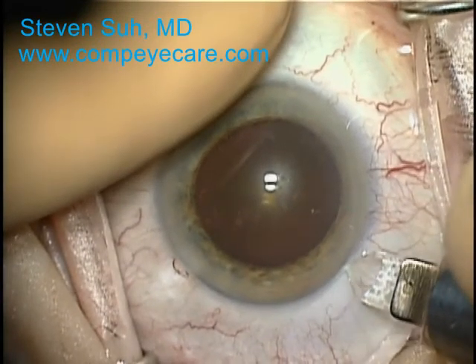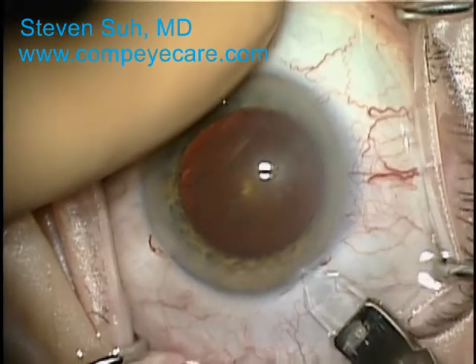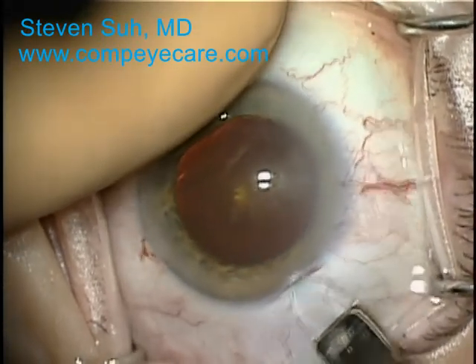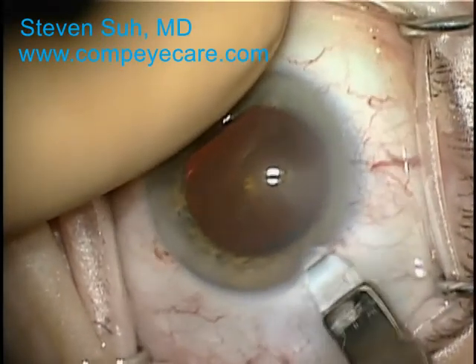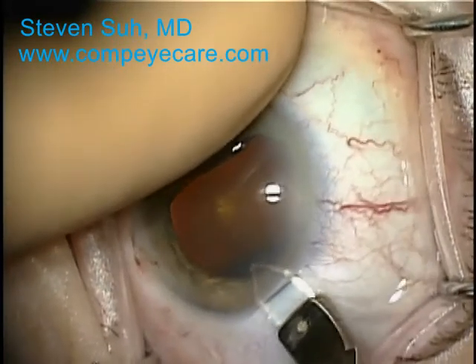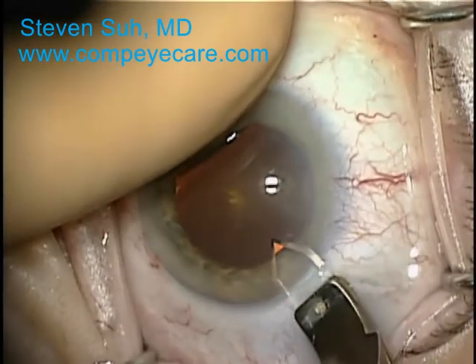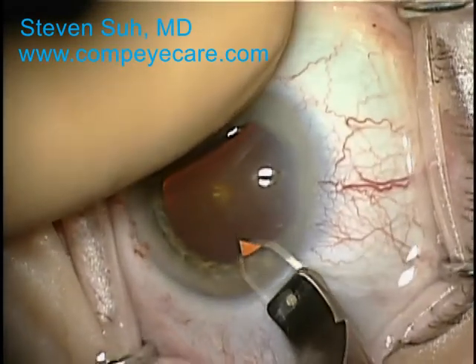I am making the main incision here, which is usually less than 3 millimeters in width. In this case, both blades were diamond blades, so obviously they are extremely sharp. It is important to make a smooth, beveled incision so that it can close spontaneously after I am done. We call this a self-sealing incision.